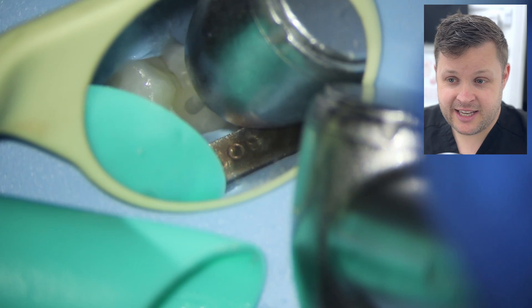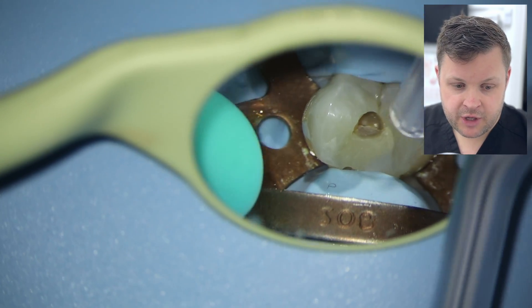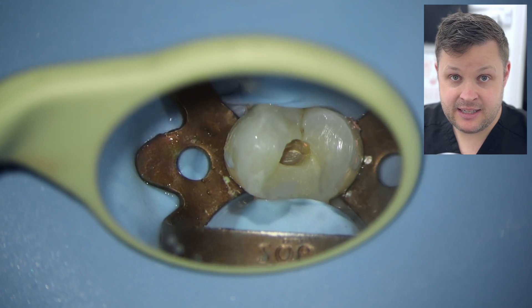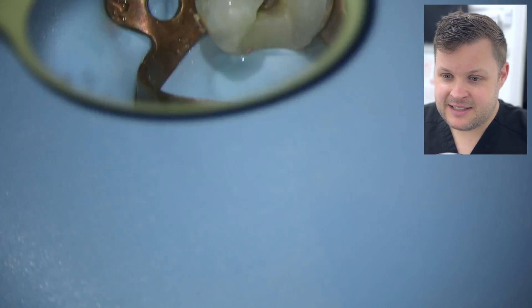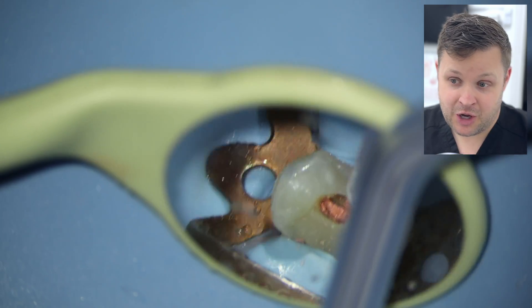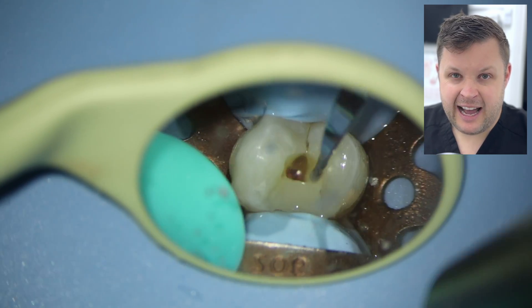The composite filling in this case is sound, so all I'm going to do is access the tooth right through the middle. I noticed I was slightly going off-axis — very easy to do with a premolar, as the occlusal plane of the patient wasn't in the same plane as the long axis of the tooth. I re-angulated my bur and finally managed to unroof the pulp chamber, and I can see GP now. I'm using an ultrasonic to break apart the GP and any loose restoration.